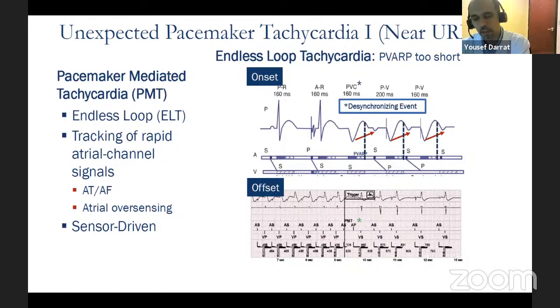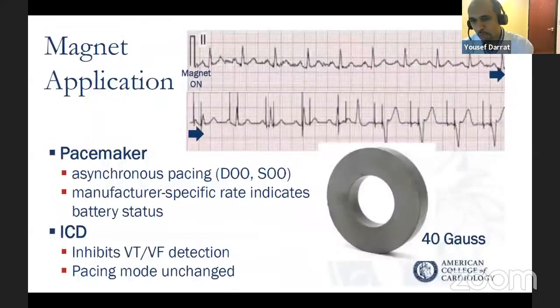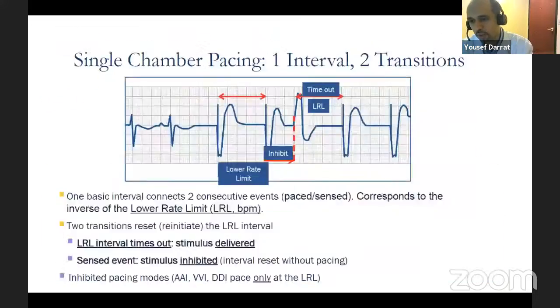Most equipment is about the radio frequency energy. If it's a high frequency, there's some interference. I'm not an expert in that field, but EMI can happen with some equipment, for example arc welding. For ICD patients, we recommend they don't arc weld. No chainsaws. For pacemakers, generally I tell patients they can use a microwave. Everyday equipment is fine.